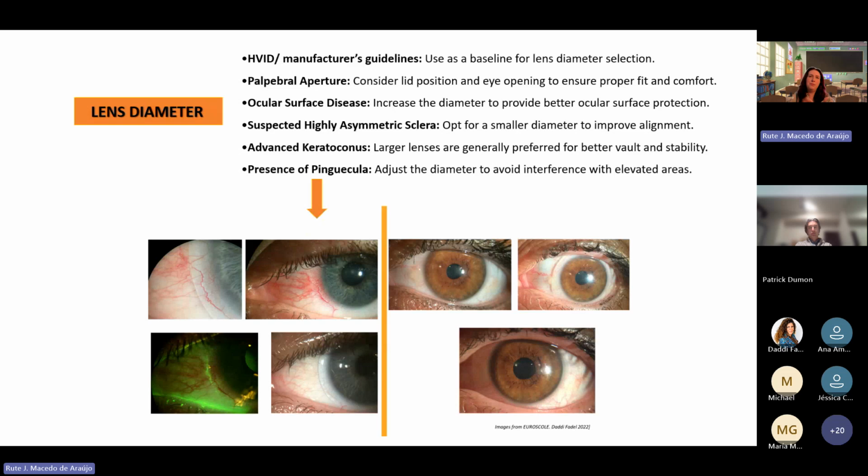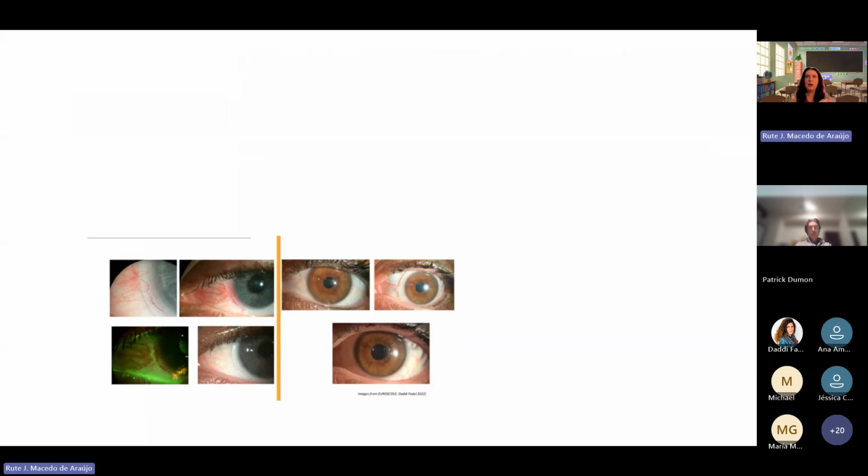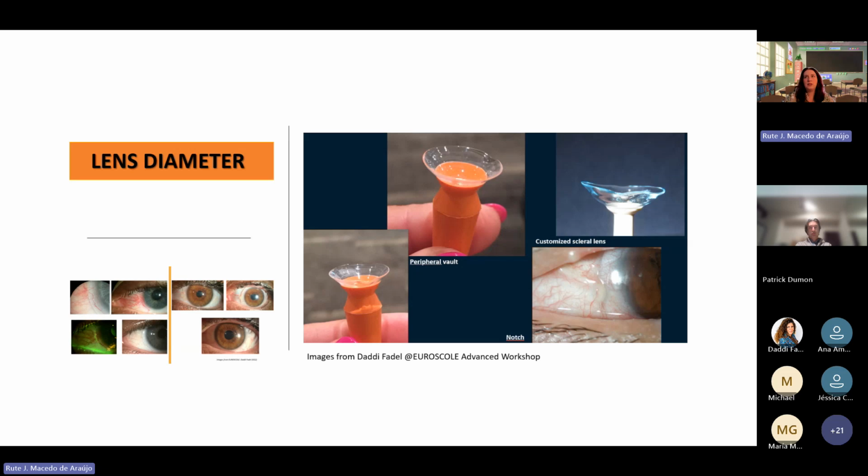So if the pinguecula is near the limbus, we can have bigger lenses to pass through this elevated area. But if the pinguecula is far away from the limbus, we can have smaller lenses to not touch that pinguecula. Of course, we can also ask the manufacturer to do some customizations like a peripheral vault to vault over that elevated area, or doing a notch.